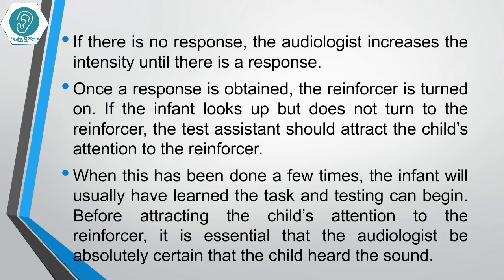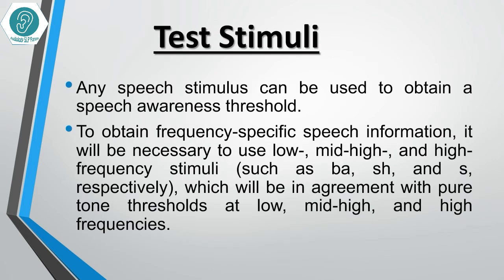When this has been done a few times, the infant will usually have learned the task and testing can begin. Before attracting the child's attention to the reinforcer, it is essential that the audiologist be absolutely certain that the child hears the sound.